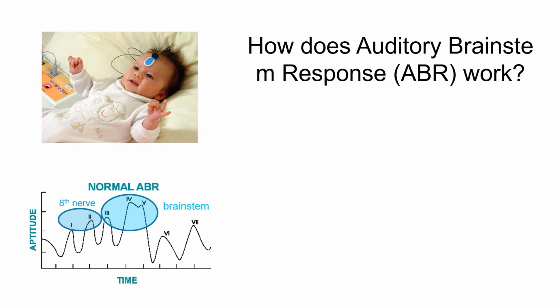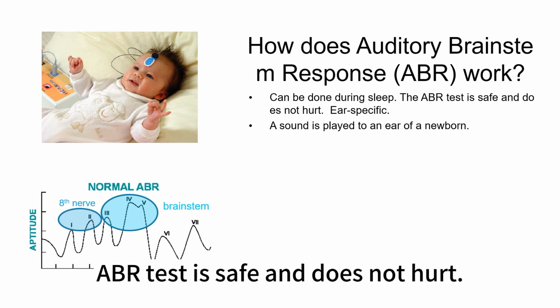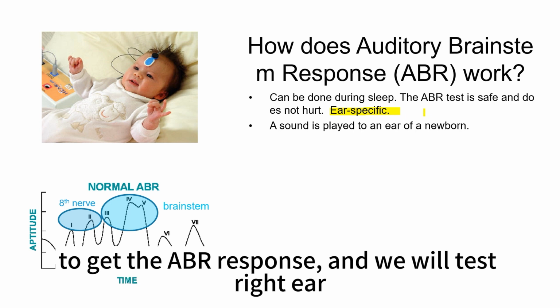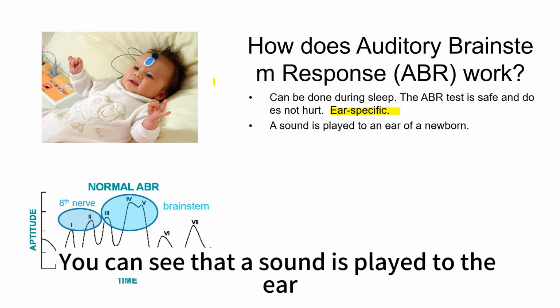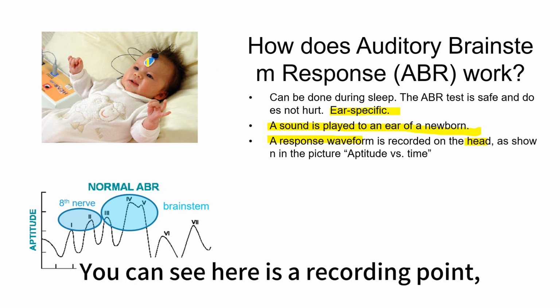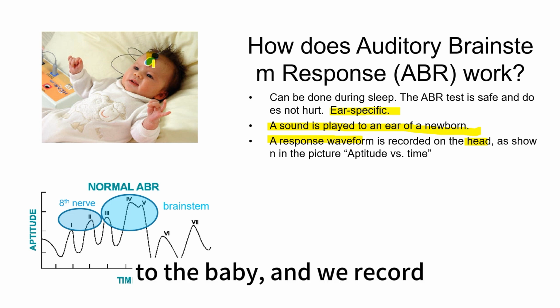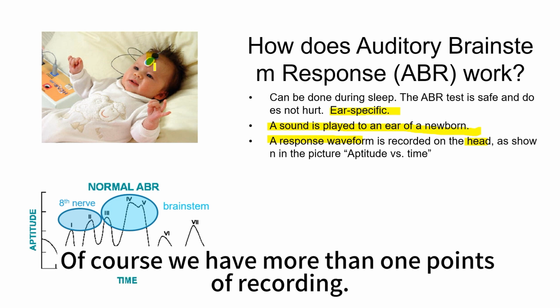How does ABR work? ABR can be done during baby sleep. The ABR test is safe and does not hurt. It is also ear specific, which means we will test the left ear to get the ABR response, and we will test the right ear to get another response. So you can see that a sound is played to the ear of a newborn, and a response waveform is recorded on the head. As you can see, here is a recording point, and we play sound to the baby, and we record the brain activities on the head. Of course, we have more than 1 point of recording.